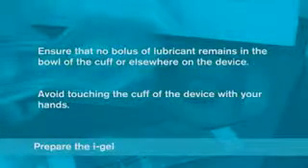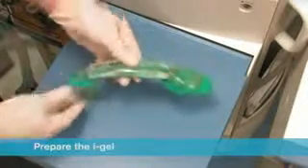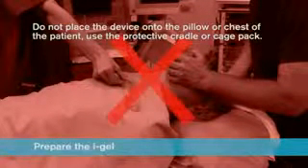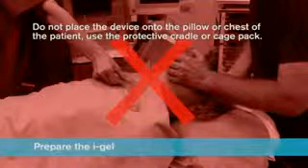After lubrication has been completed, check that no bolus of lubricant remains in the bowl of the cuff or elsewhere on the device. Avoid touching the cuff of the device with your hands. Place the iGel back into the protective cradle or cage pack in preparation for insertion. Do not place the device onto the pillow or chest of the patient. Always use the protective cradle or cage pack.